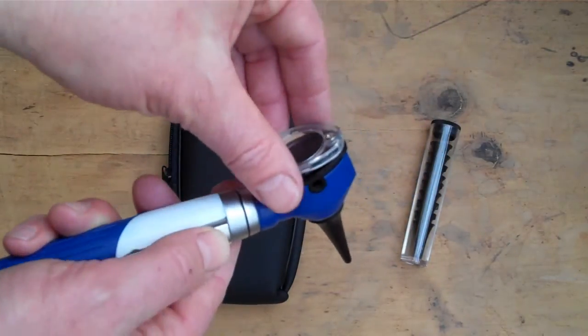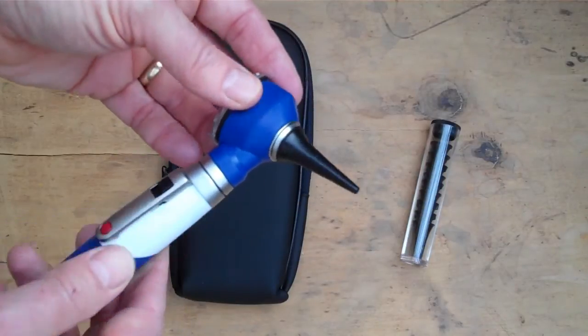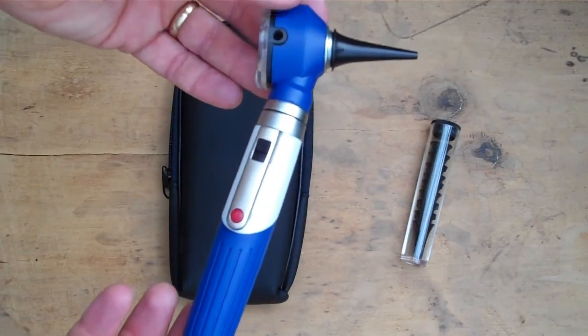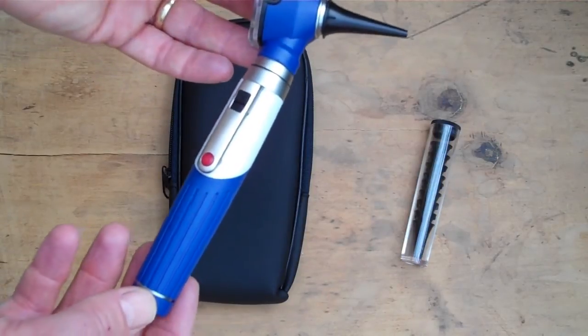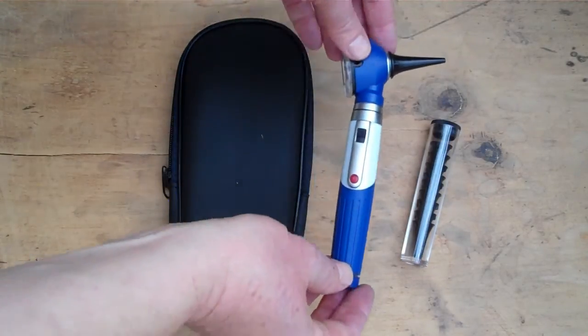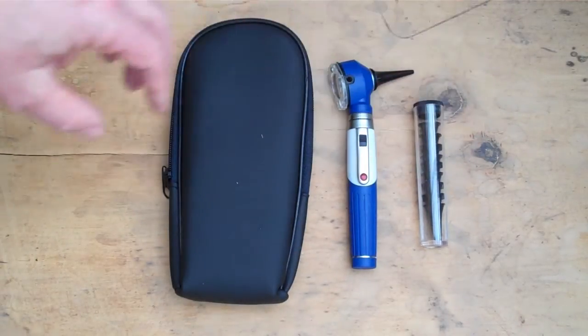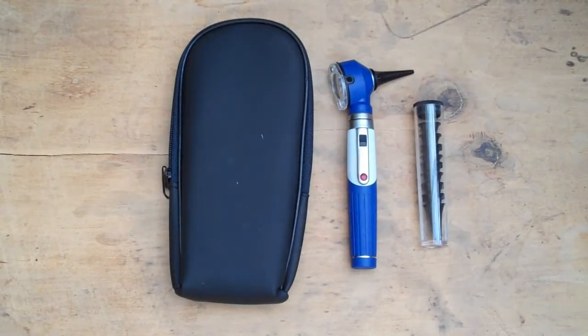To demonstrate the light function and visibility through it when switched on — it's very good, giving excellent visual examination function for an otoscope. When these units were first imported into the UK, equivalent branded products were selling for between 100 and 200 pounds.